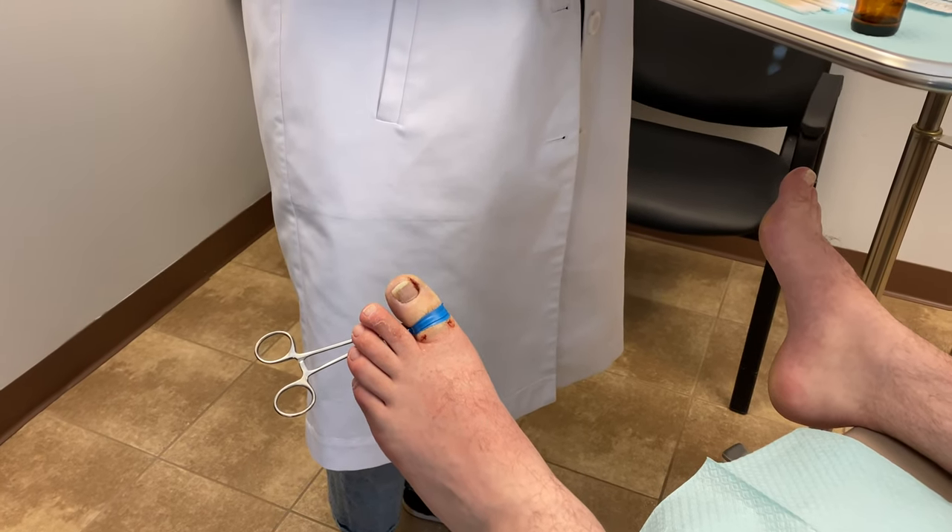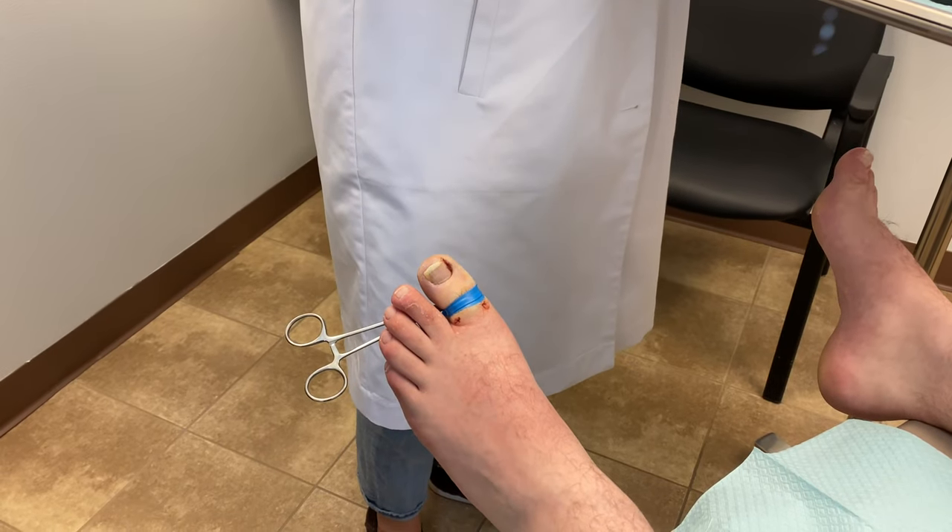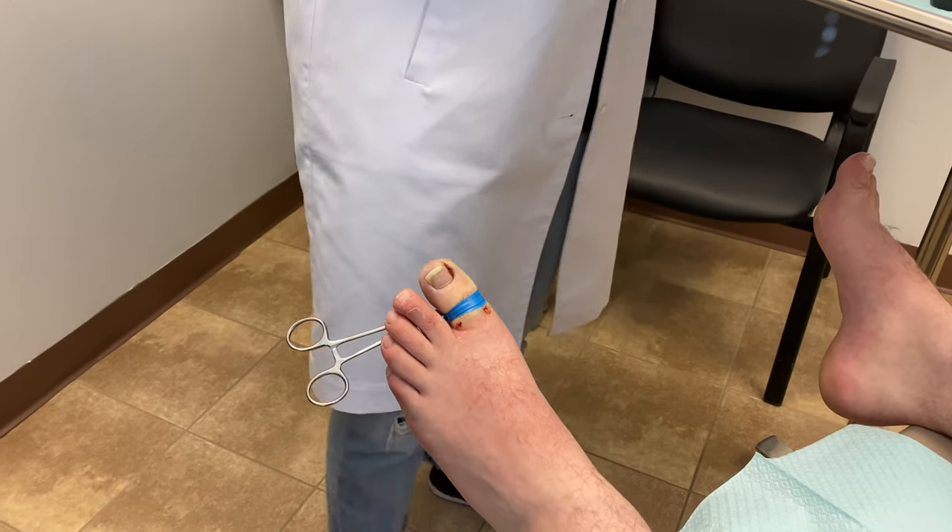Today we're going to show you a procedure where we perform an ingrown toenail removal and kill the matrix where the nail grows from, so the nail will not return.